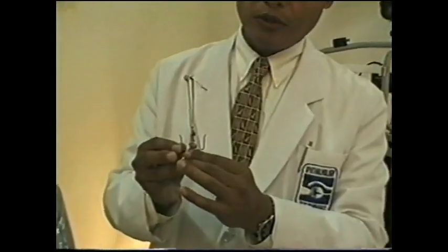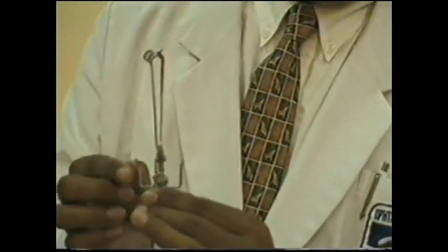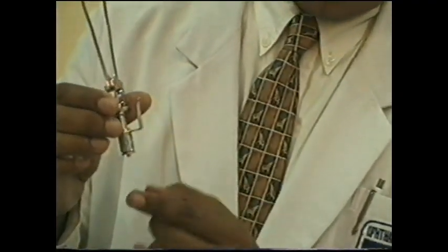A more objective means of assessing intraocular pressure would be the use of the Schiotz tonometer. This is your standard Schiotz tonometer, and its basic parts are your scale, two arms, the plunger, and your pressure plate.